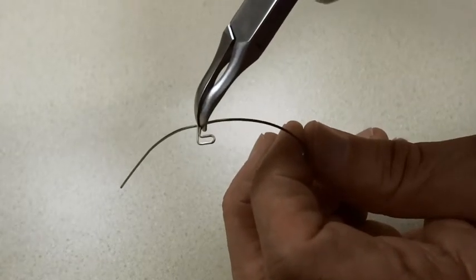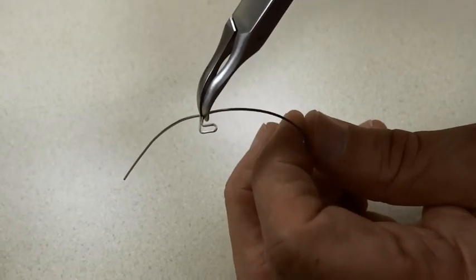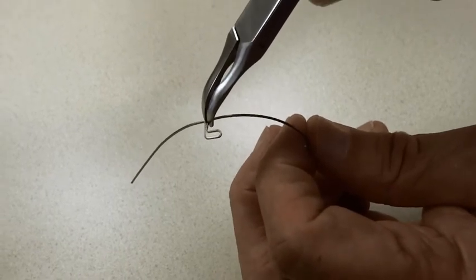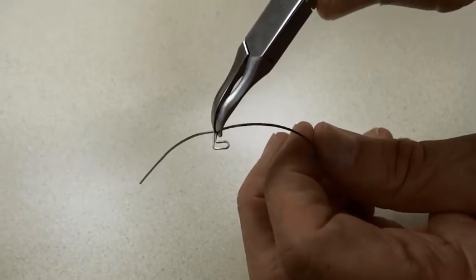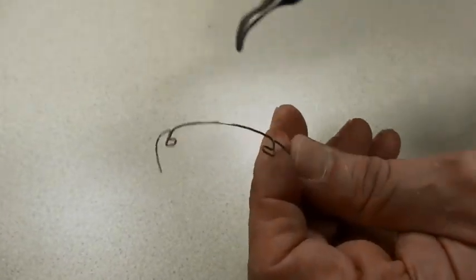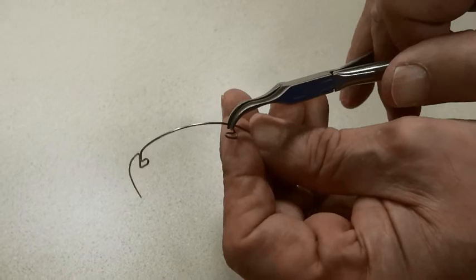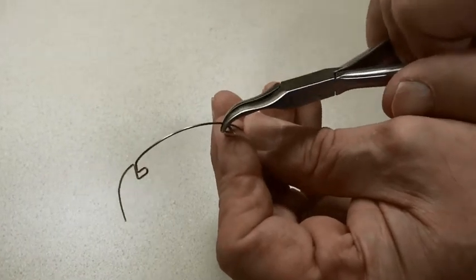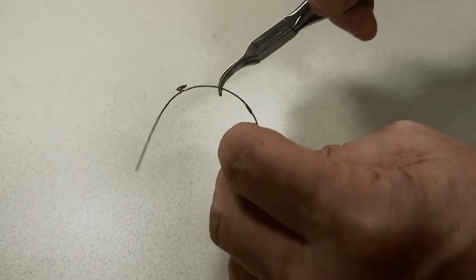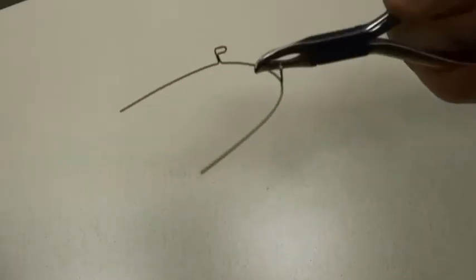If you wanted to detorque, presuming there was too much torque in the upper incisors, all you need to do is hit this corner, squeeze, and then do the opposite. Again, at the same corner on the opposite side, squeeze, and you would have detorqued.